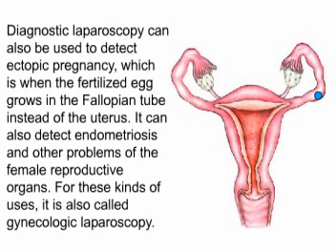Diagnostic laparoscopy can also be used to detect ectopic pregnancy, which is when the fertilized egg grows in the fallopian tube instead of the uterus. It can also detect endometriosis and other problems of the female reproductive organs. For these kinds of uses, it is also called gynecologic laparoscopy.